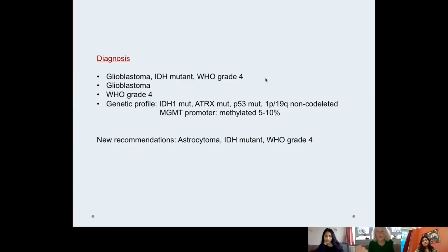When we have a de novo glioblastoma, so the IDH wild type glioblastoma, it is typically a high-grade tumor throughout. But when it's a low-grade glioma, an astrocytoma transforming into a high-grade, what we see is foci of mixed lower-grade and higher-grade areas. An important change we anticipate in the new classification, and these tumors will not be called glioblastoma anymore. Many of you probably know them as secondary glioblastomas, the IDH mutant glioblastomas, because they arise from lower grade astrocytomas.